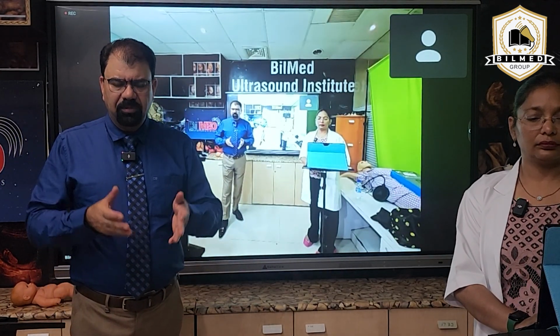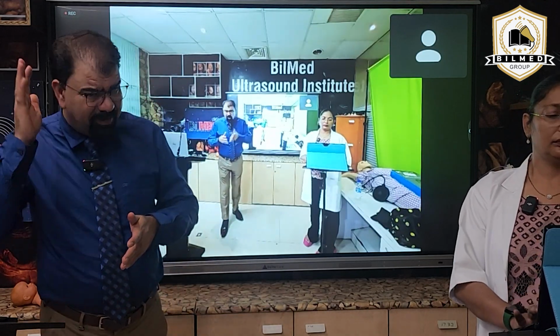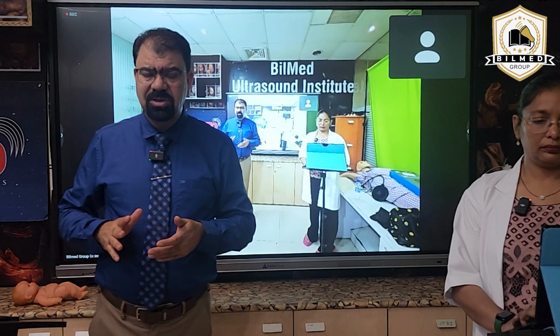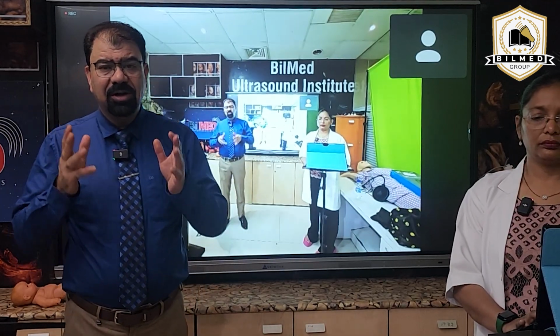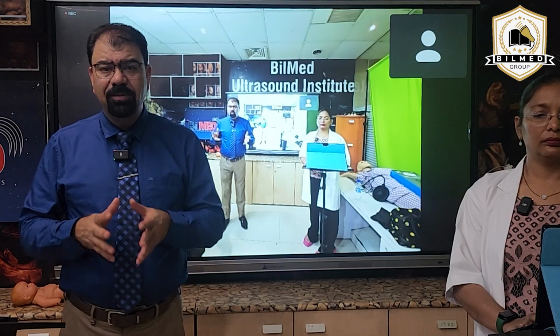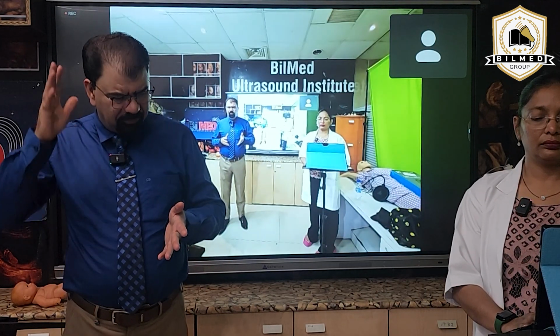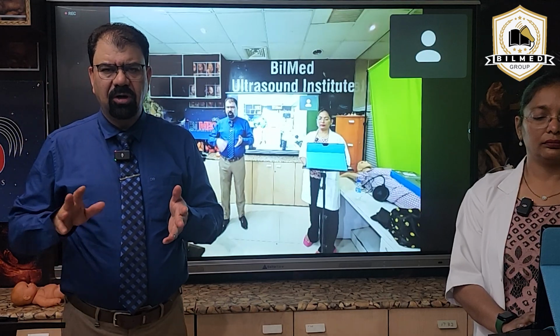See for the mid-sagittal section. Try to get the mid-sagittal. Forget about the nose, forget about nuchal translucency, forget about ductus venosus. Try to get the mid-sagittal section only. And once you get the mid-sagittal section, your nasal bone will pop up and all the components will pop up.